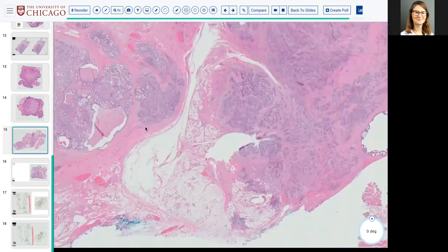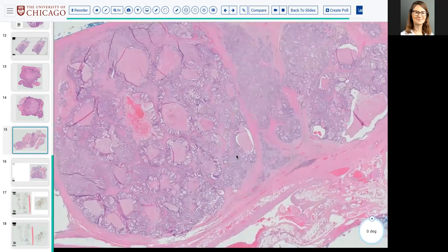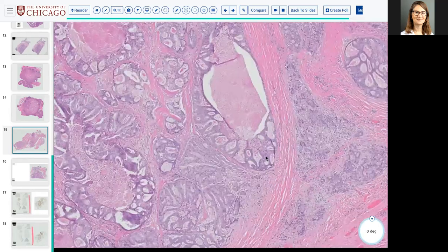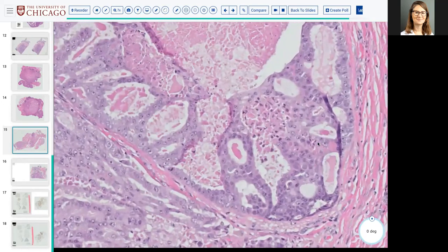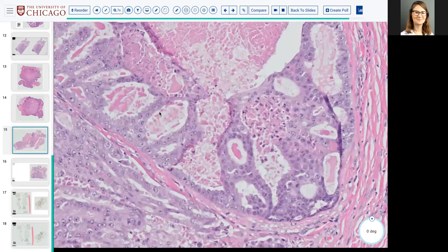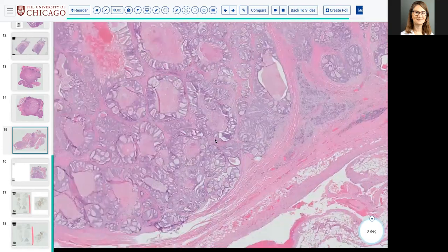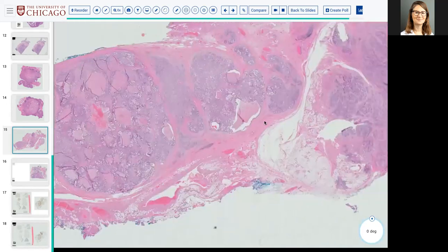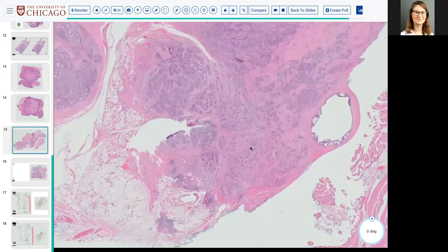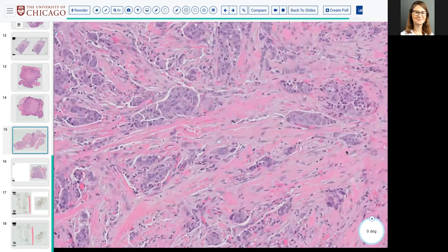So one of the buzz ways of noticing and correctly identifying salivary duct carcinoma of salivary gland is to put in your brain that it kind of looks like high-grade cribriform DCIS with central necrosis. But unlike DCIS, this is all invasive. This is all just broad-based lobulated invasion. And in cases over here, you even have small nested invasion within a desmoplastic stroma.